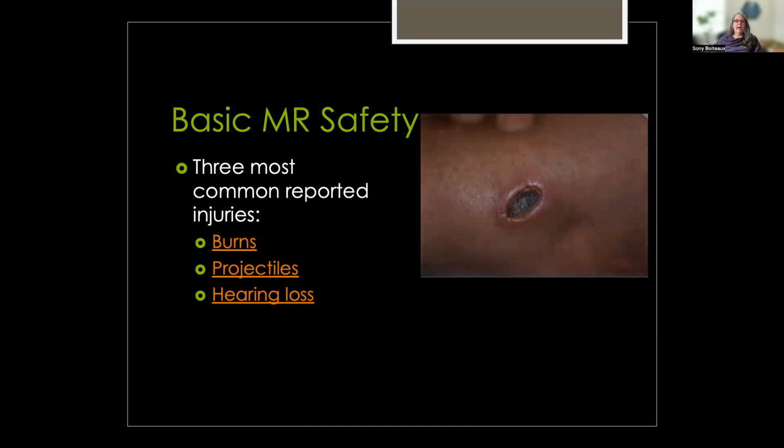Okay, so when the system has calculated based on the magnetic field strength and the gyromagnetic ratio of hydrogen, that's a real fancy constant, don't worry about that, but just know that the software of the system is doing that calculation constantly and determining what radio frequency pulse it needs to send out so that it will cause resonance in the patient's tissue. And when that radio frequency energy is absorbed by the patient's tissue, that causes heating.